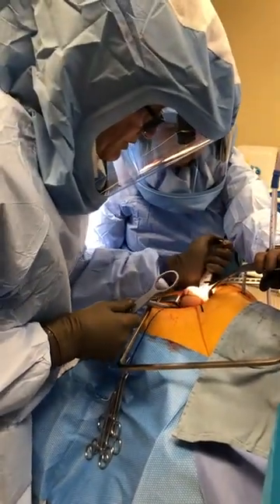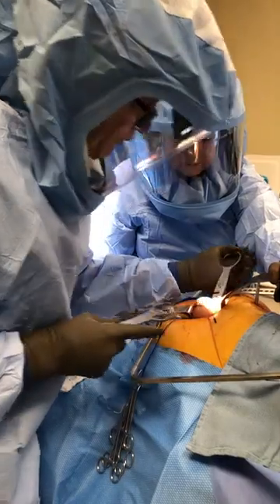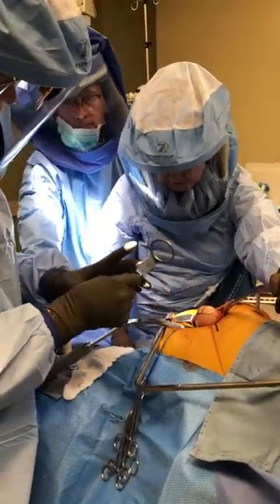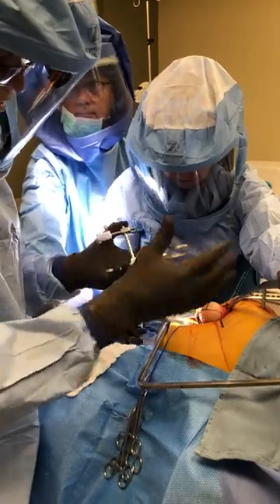48, 46, 44. The 44 fits on nicely with just a little wiggle, and that's what I like. So that's the smallest implant I could put on for the hem, and so we're going to prepare the femoral cut for this implant, and then we could always downsize.